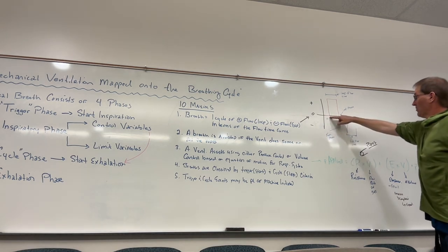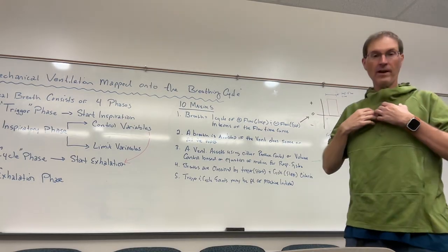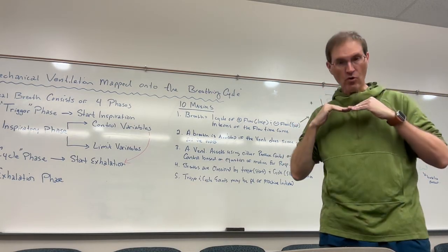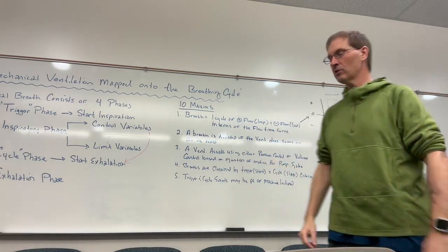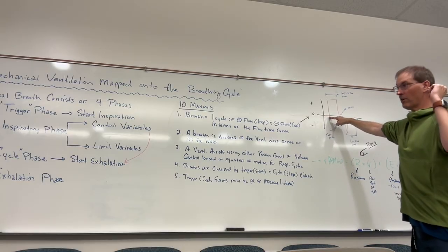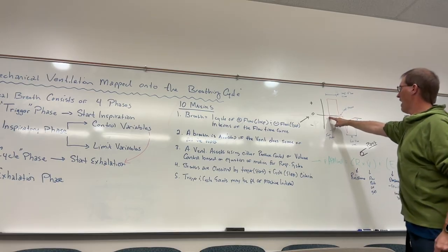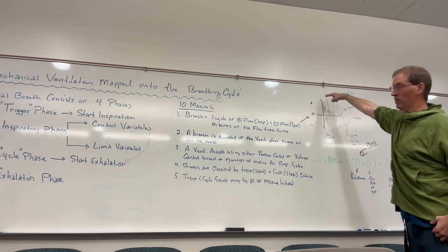You have your expiratory pause, at the end of exhalation. So you're exhaling, and at the very end of exhalation, when air quits flowing, right before the onset of inspiration, you have your pause. There's no airflow. And then what happens? The ventilator is triggered, inspiration starts, and air flows rapidly into the respiratory system.